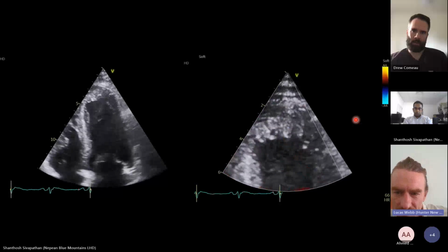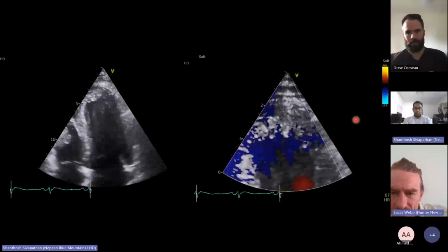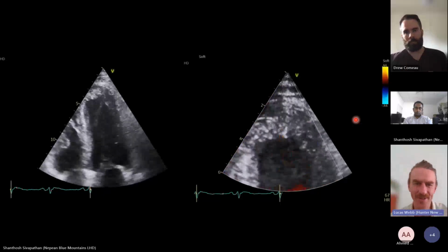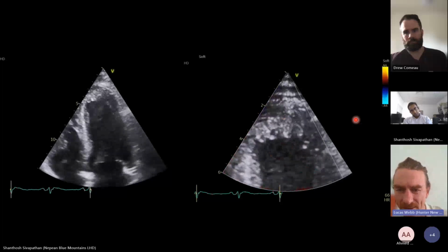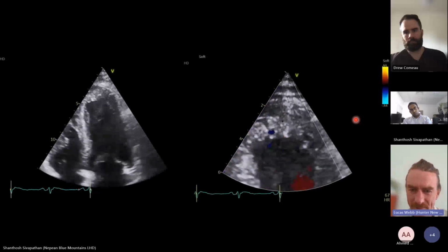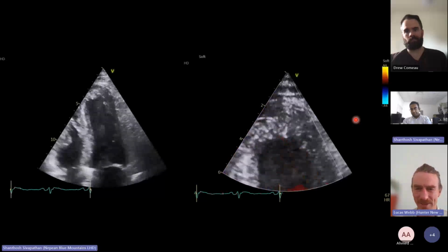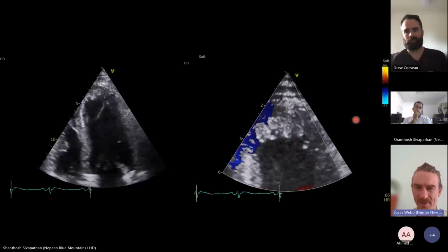So, do you think there's a clot there, or not sure? Myself, not sure. I'm leaning towards no, because at least on one grab on that color view, I'm getting a flash of red going right to the apex. I think that warrants probably a contrast study. There might be, on the septal wall, a little area that's not ever lighting up in that zoomed up view.